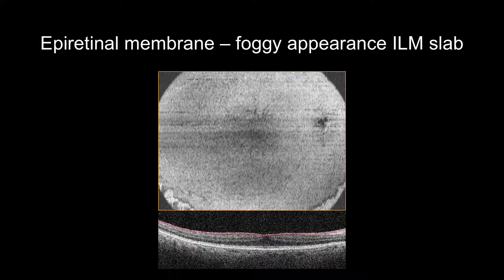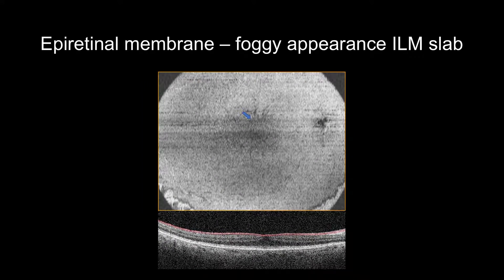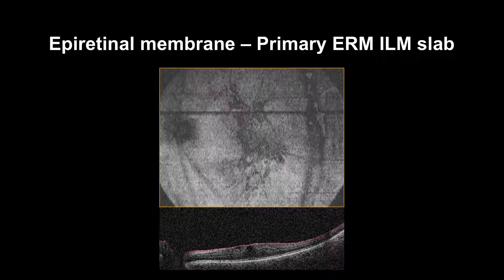In some cases, the EnFace will appear foggy due to focus on the posterior hyaloid or deeper tissue. Please note how the fovea is intact. In some cases, the fovea will appear intact, distorted, or absent.